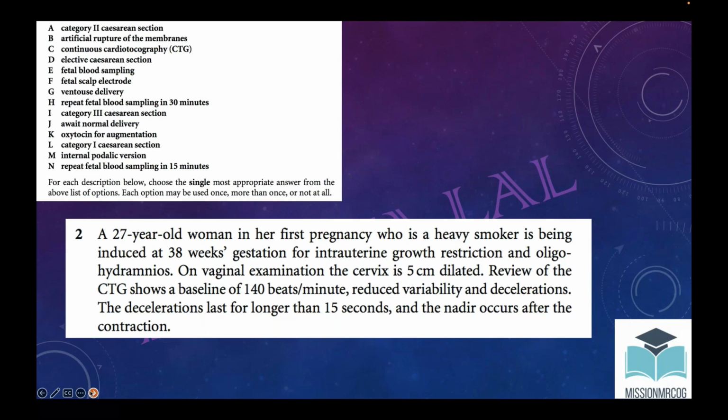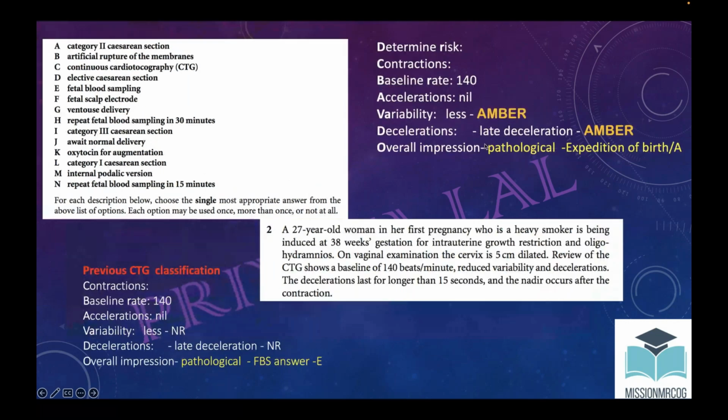Duration of decelerations, ma'am. The period has not been given. But even then, it is pathological. We should reduce, like variability as well as late deceleration. So variability is less, and late deceleration I have put at amber. I just want to tell you that it becomes pathological.